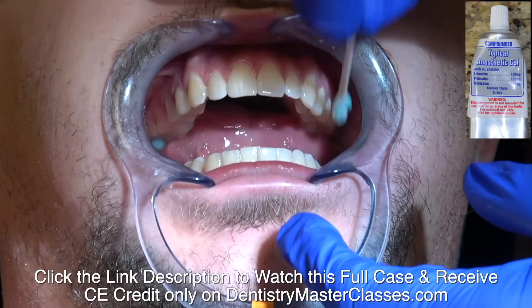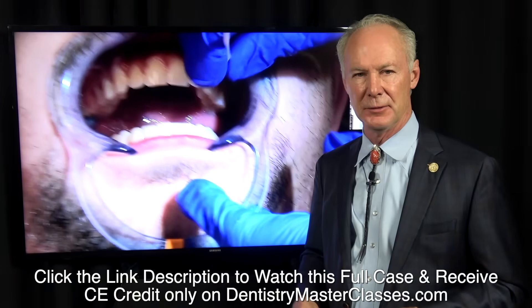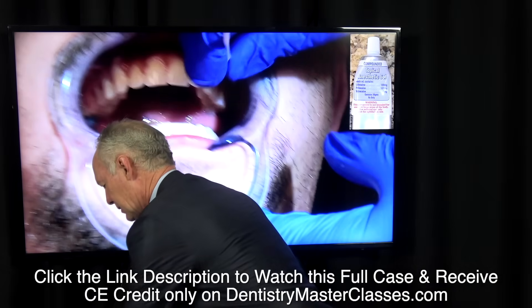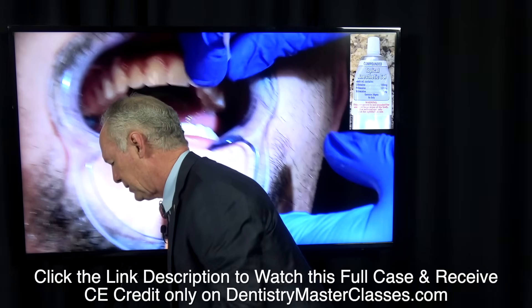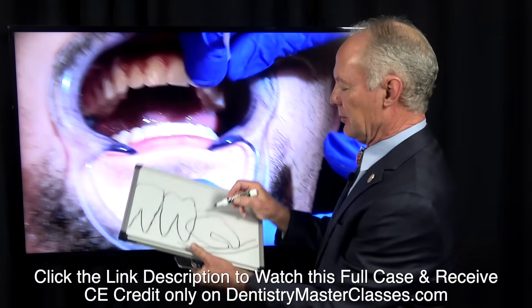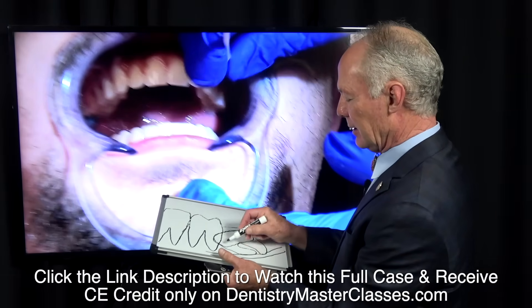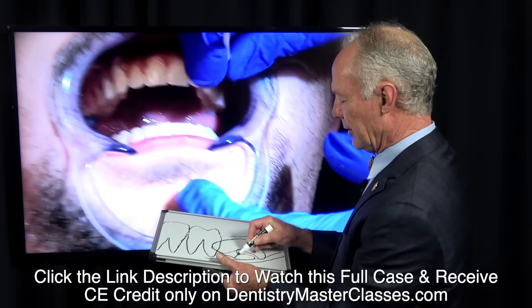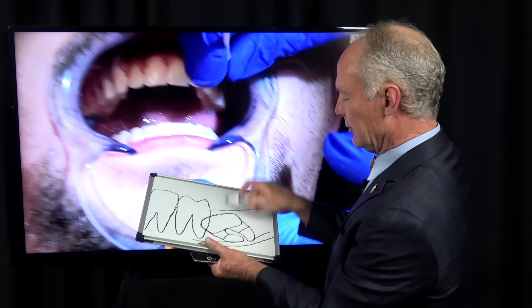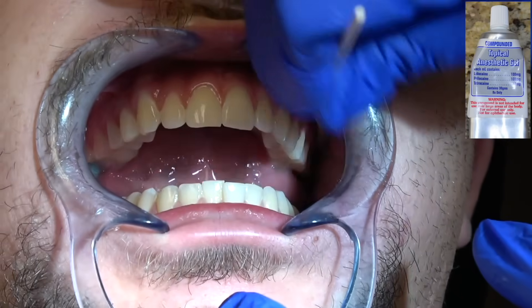This is the lower left of a 23-year-old male. Now this is another reason why, if you're going to remove wisdom teeth, you'd like to do it when the roots are about 25% formed. You don't want to do it when the patient is so young that you only have the coronal part of the tooth, because it'll just spin when you try to elevate it. You'd like to have about 25 to 30% of the roots formed, which keeps the piece from spinning. But when you have completely formed roots, that's a difficult wisdom tooth.